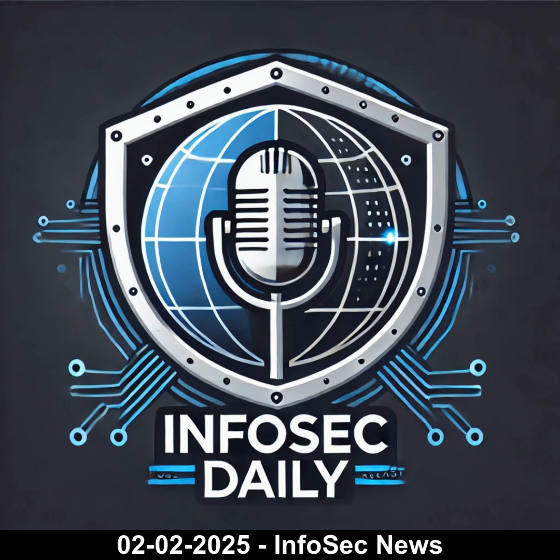So what can hospitals do? Is there a fix? Unfortunately, as of today, February 1st, 2025, no patch. So they're just vulnerable. The FDA is recommending disconnecting the devices from the internet for now, sticking to local monitoring only. That's a Band-Aid solution. This is a much bigger issue, isn't it? It's not just about these two specific devices. Absolutely. It raises concerns about all sorts of connected devices in healthcare, from infusion pumps to electronic health records. The whole system is potentially at risk. It's a chilling reminder that cybersecurity impacts more than just our computers and phones. It could have life or death consequences.